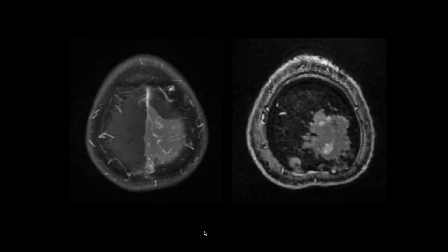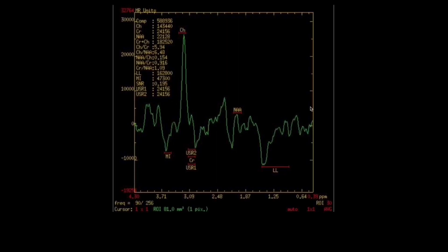On the MR contrast image, there is clearly homogeneous enhancement of the lesion. On MR spectroscopy, the choline peak is increased and the NAA peak is reduced. The alanine peak is increased and there is a lipid-lactate peak.